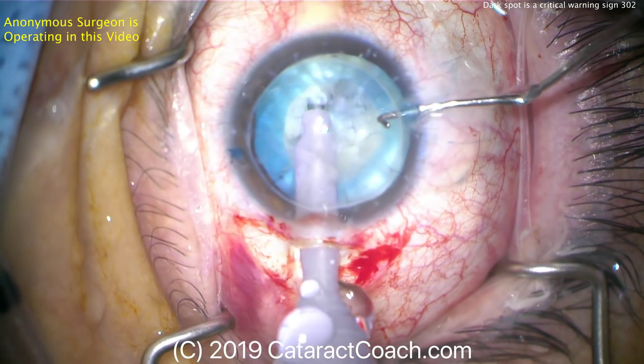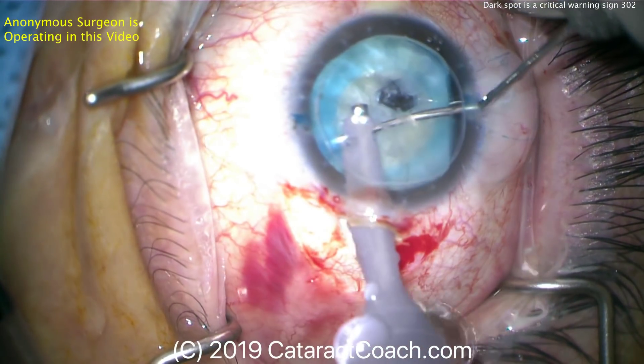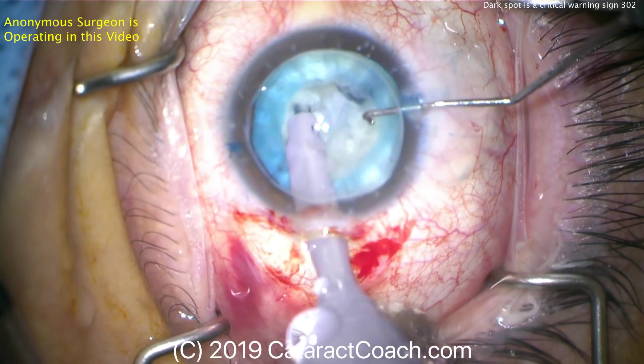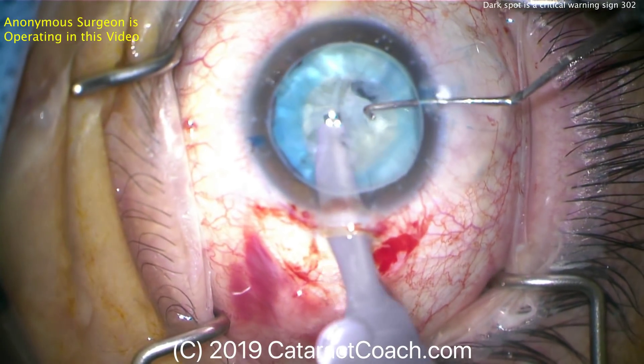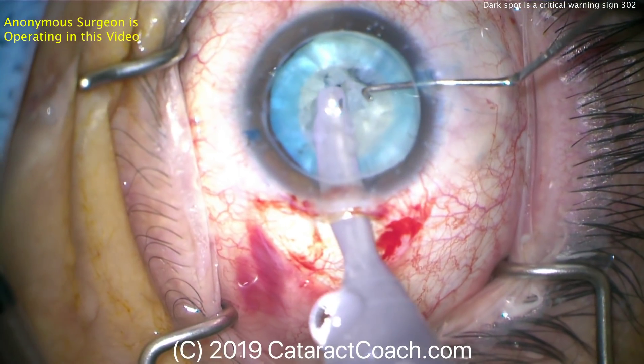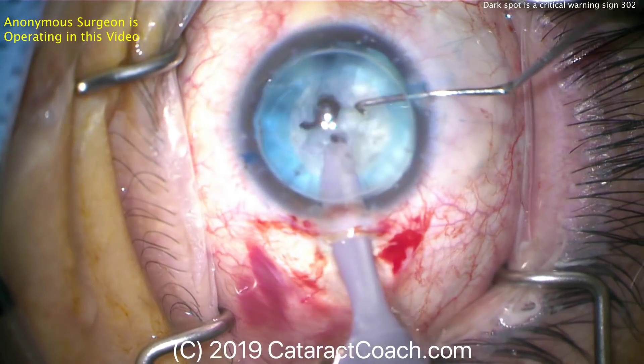In all likelihood the capsular bag is now broken. That hole is a hole in the posterior capsule. Remember this lens material is soft — very soft. By using this higher vacuum setting, the phaco probe went right through the lens material and nailed the posterior capsule. That dark spot is a huge warning.